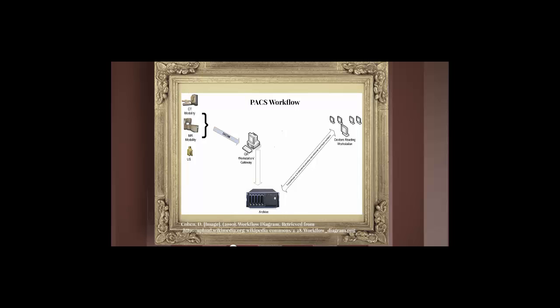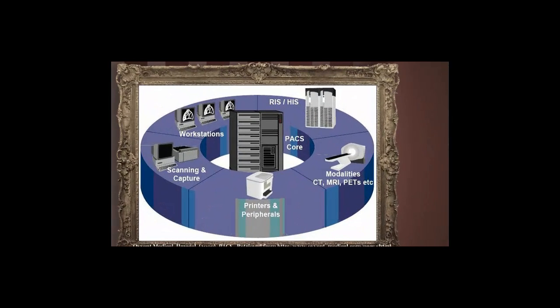And the beauty of it, what's so nice about it, is you don't have to have a radiologist on site to go hang your films in front of, because it's all computerized over the internet with tons of secure software, of course, because you're dealing with HIPAA issues now. A radiologist can read literally anywhere in the world using PACS if they have the privileges to get in there and look at it.